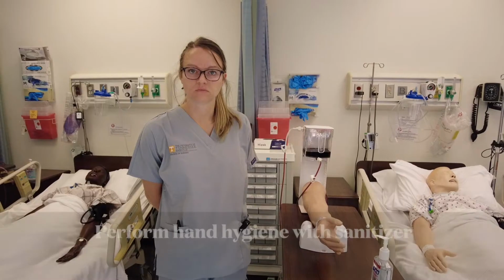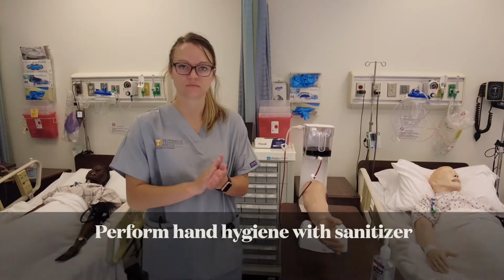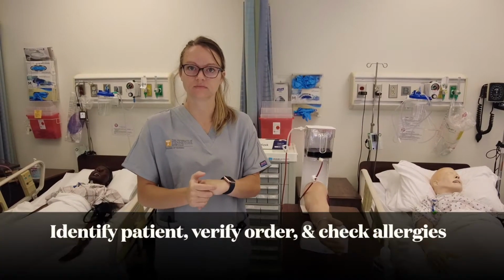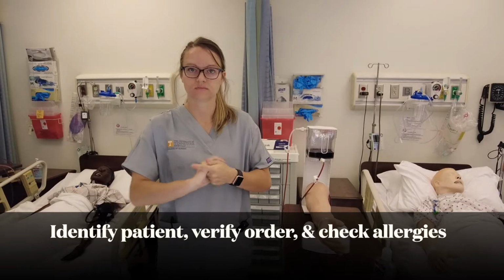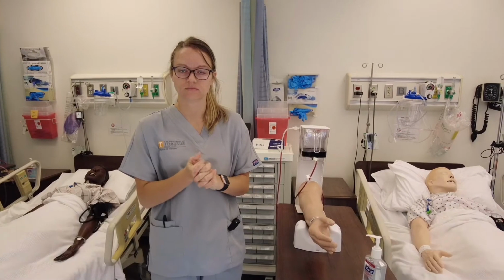This video demonstrates successful completion of peripheral venous access. Perform hand hygiene with sanitizer at bedside. Identify patient with two indicators, name and date of birth, checking the EMR and the name band, verify order, and check for allergies.